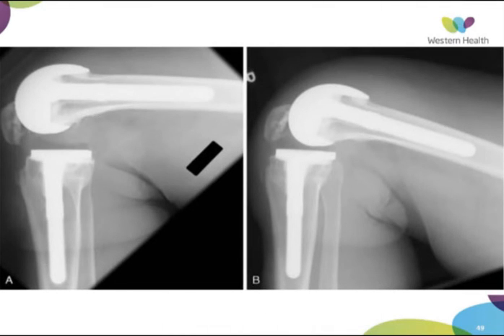Here's an example of a cam jump where the femoral component has gone over the top of that tibial post, and this generally needs a general anaesthetic to reduce in a flexed position with some distraction on the tibia, and then performing effectively an anterior draw to get that tibial post back in the femoral component.